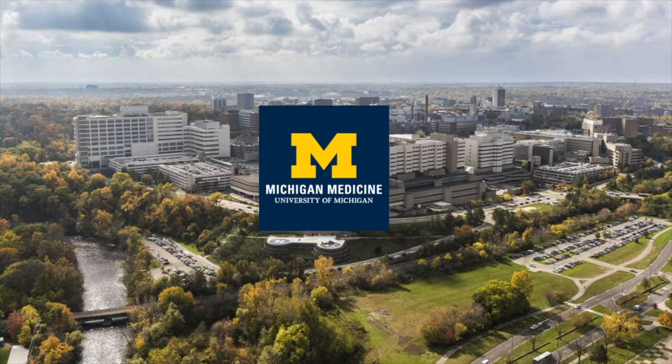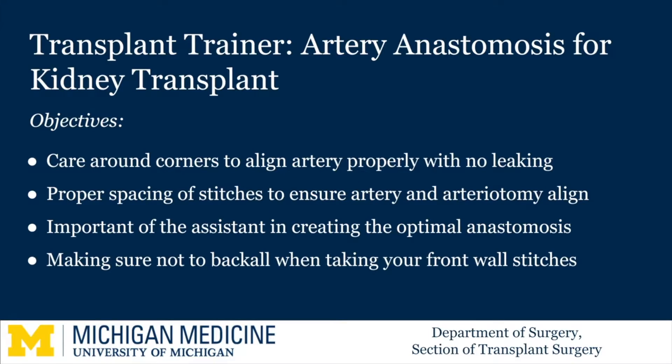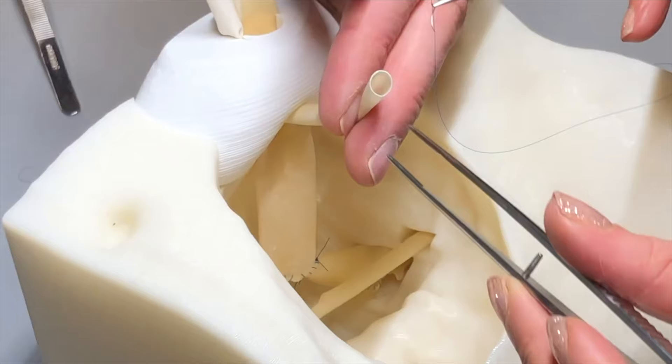Hello, I am Meredith Barrett, the Senior Transplant Fellow at Michigan Medicine. Today's video focuses on the Michigan Kidney Transplant Trainer and sewing the arterial anastomosis. Notably, we have highlighted the renal vein anastomosis on the trainer previously, and it has been performed prior to the artery, as we would do in a standard kidney transplant.